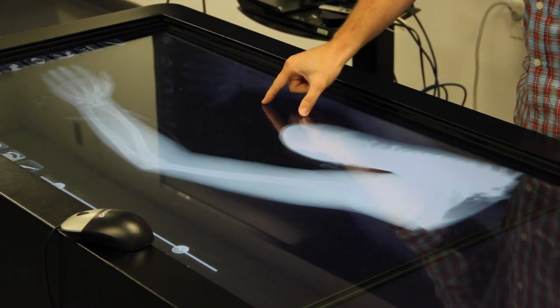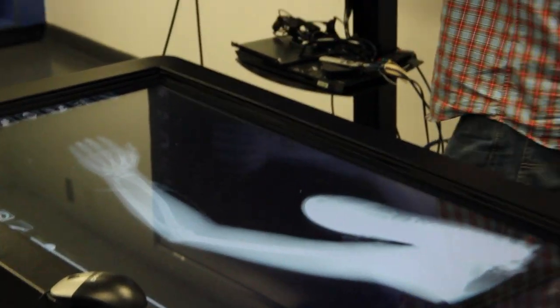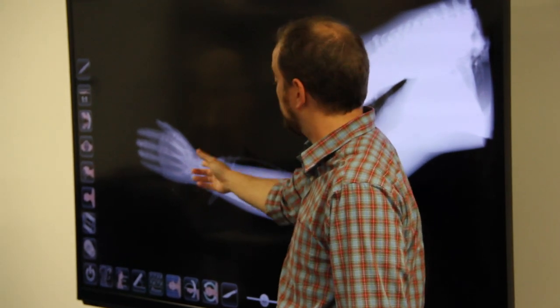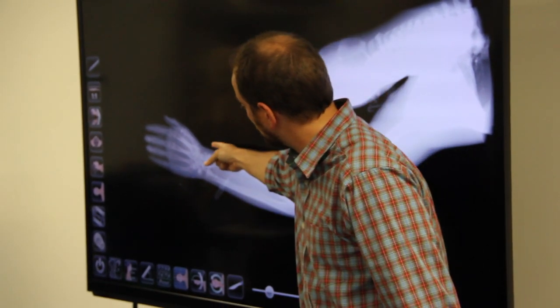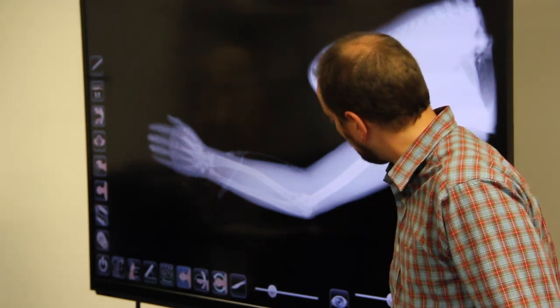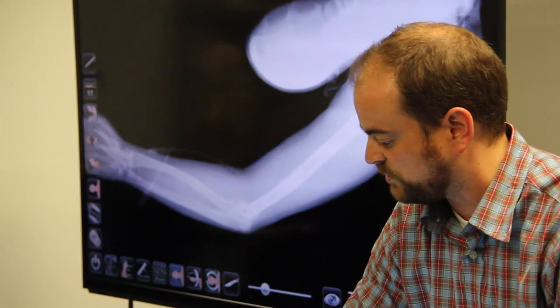So we can see a lot of those same structures. We can still identify where the scaphoid and lunate are down here at the distal end of the radius. We can see where the epiphyseal plates would be. Now we can see our orientation, we'll zoom in a little bit.